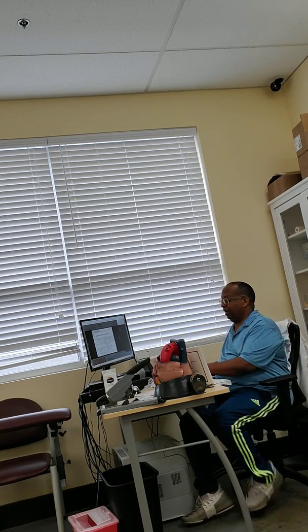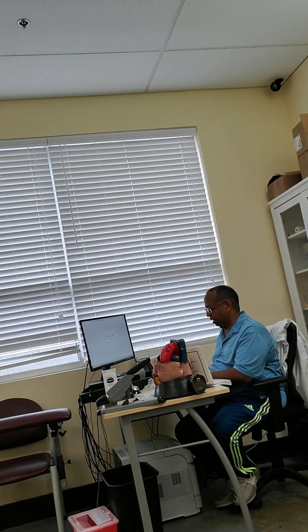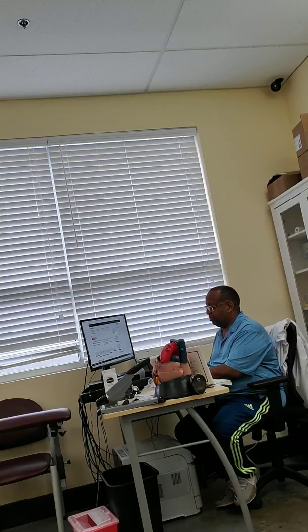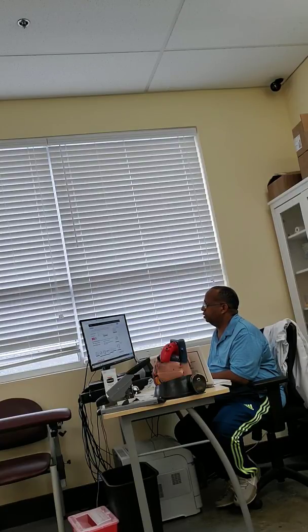Or you can go online and there is what we call Bazett's online calculator. You can do it online. QTc calculator, this one. So write the heart rate in beats per minute. Let's say your heart rate is 70. And let's say you got 360 on the QT interval. This one is in what? In milliseconds. You have to change it to milliseconds, otherwise you have to put it in seconds. So calculate it. So that's the QTc interval, which is around 388.8 milliseconds.